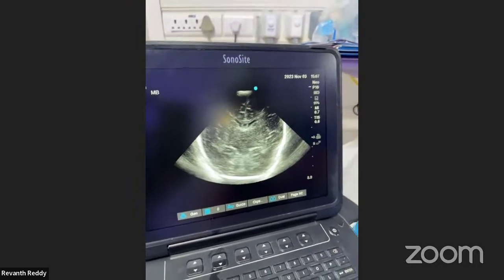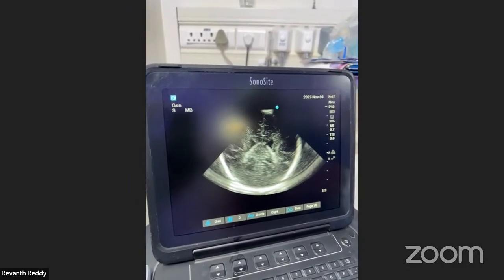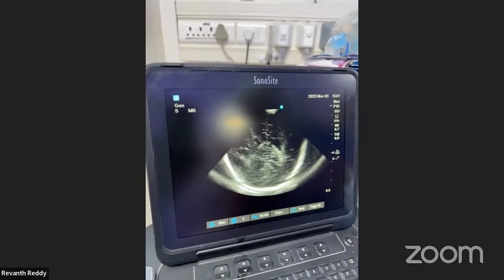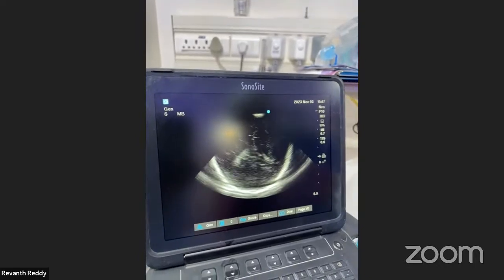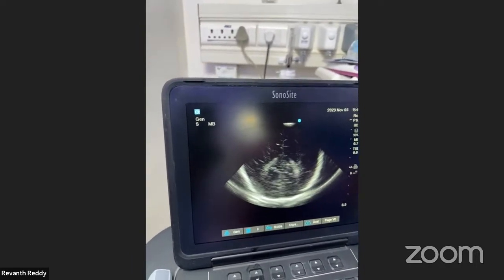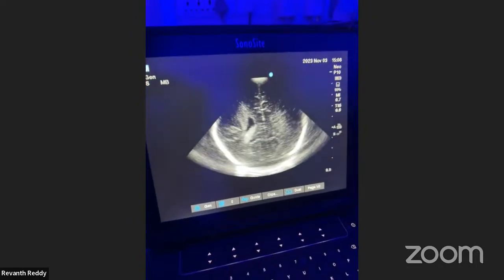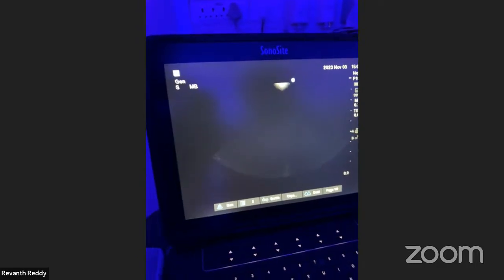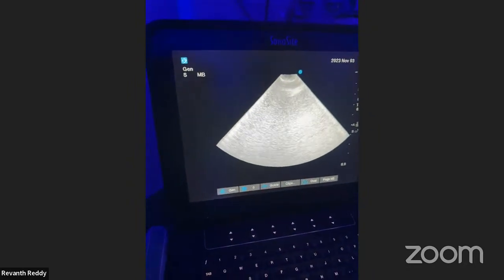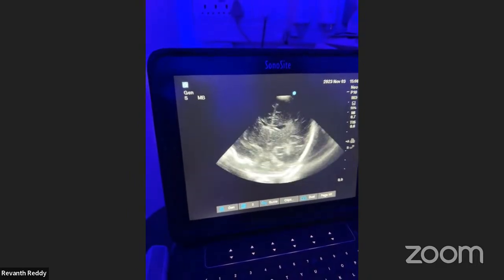And as we are going posteriorly, you will be seeing some bright structure which is arising. What is that one? This is the choroid plexus. The three dot sign we cannot make out now, but the choroid plexus is now clearly seen. This is the bright structure which arises from the caudothalamic groove. And if you go even further posterior, you will be able to see the... So posterior to the choroid plexus, we'll be seeing the occipital blush.